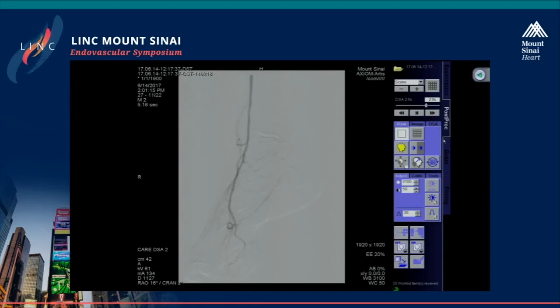It's just a matter of discussion what everybody thinks and would suggest. Leave this with one vessel or try also to reopen the second one. How can we do that? We have now installed the blood flow. Should we leave it? Should it be sufficient, and come back if the wound is not healing, or try to reach the most optimal result we can?